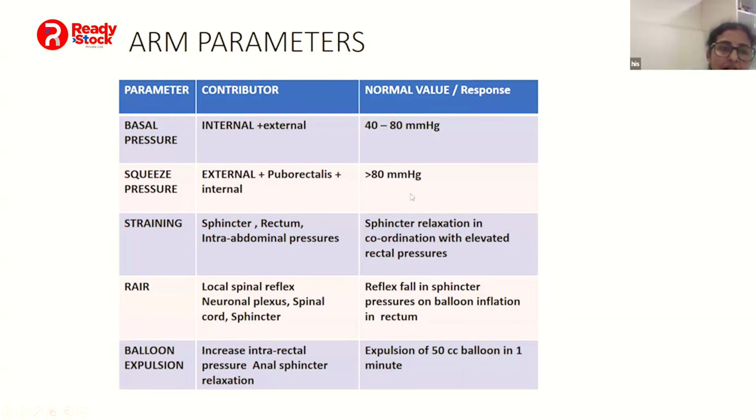So what is anorectal manometry? It is very akin to the same catheter that we use for the esophageal manometry. It is a 16-channel catheter. Of course, I talk about water perfusion catheter because that is what we use, and I do not have any experience with solid-state catheters. We find them quite easy to use and user-friendly, easy to interpret as well.